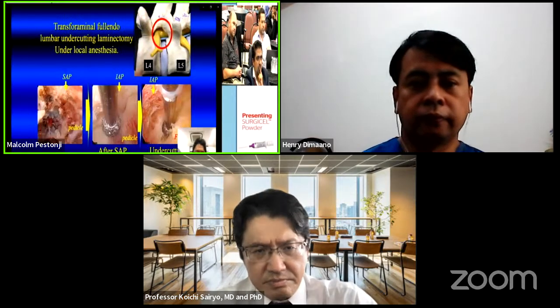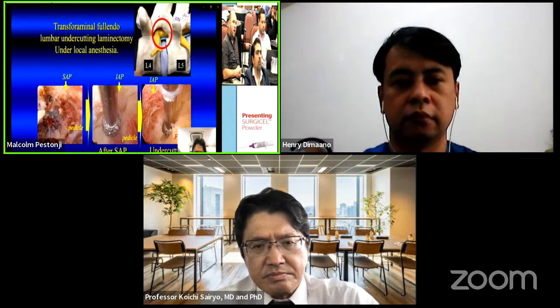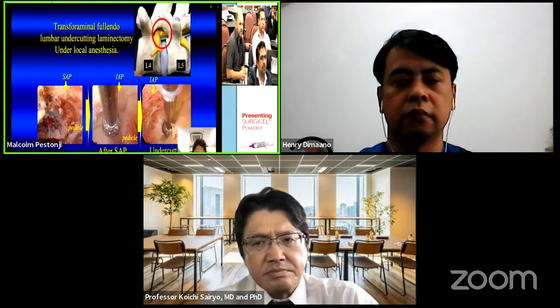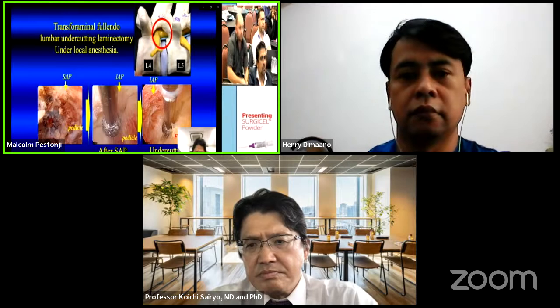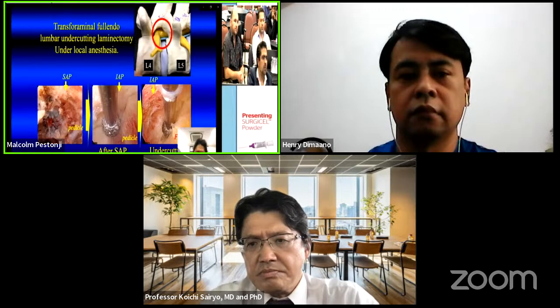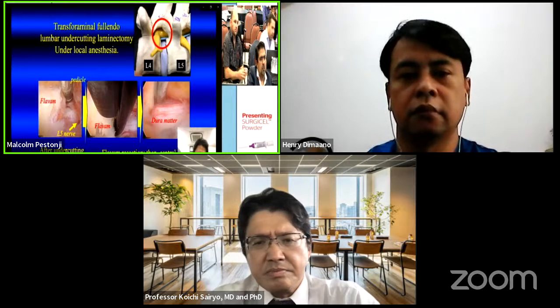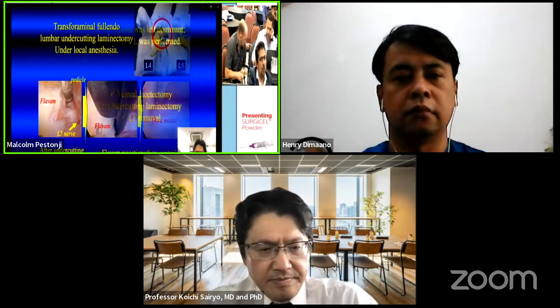Okay, transforaminal endoscopic. I think Malcolm may be performing some cases. He's doing the fusion. But I selected here: SAP removal, IAP shaving, see the volume here. So this is a thickened ligament fragment. The level is here, and I took it, and the dura mater is there.